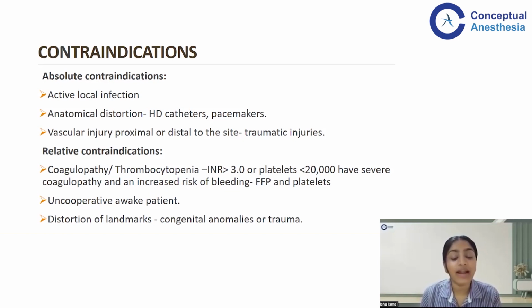And distortion of landmarks in patients with congenital anomalies or trauma can also pose difficulty in insertion of catheters.